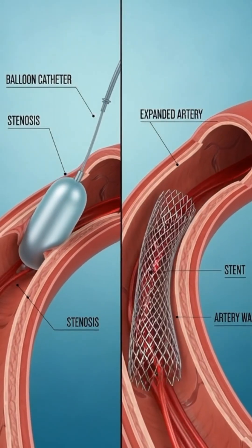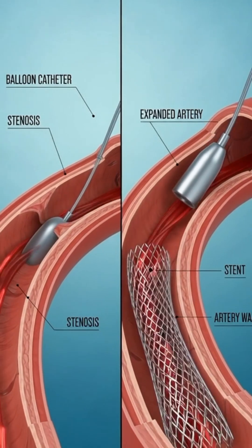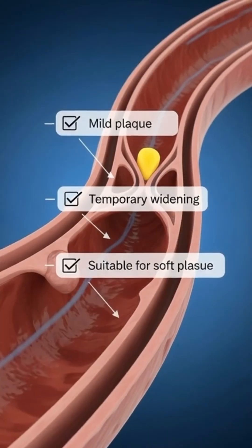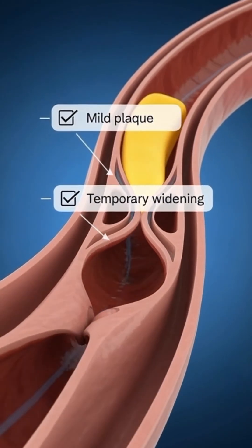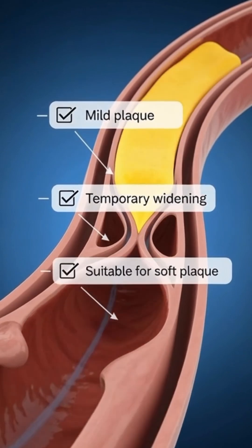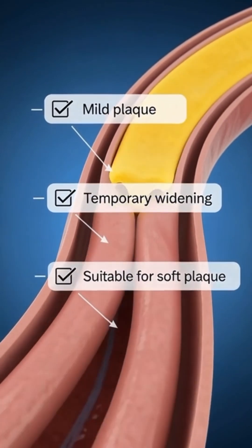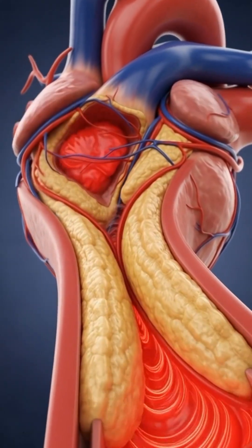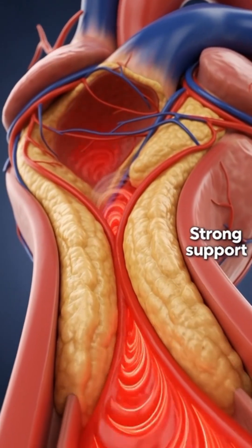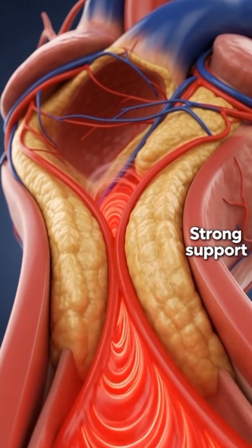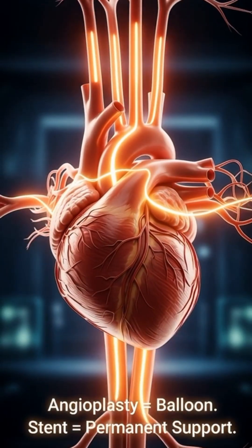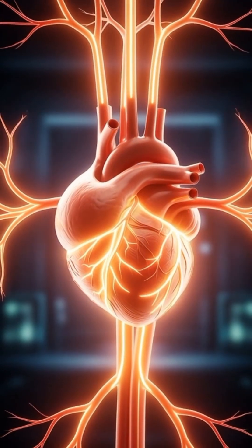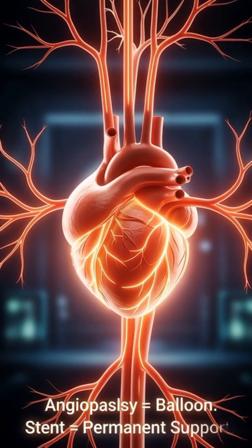Left side: angioplasty only. Right side: stent left inside the artery. Angioplasty is used when the plaque is soft and the narrowing is less severe. A stent is used when the artery is critically blocked or likely to close again. Angioplasty opens the artery with a balloon; a stent stays inside to keep it open long term.